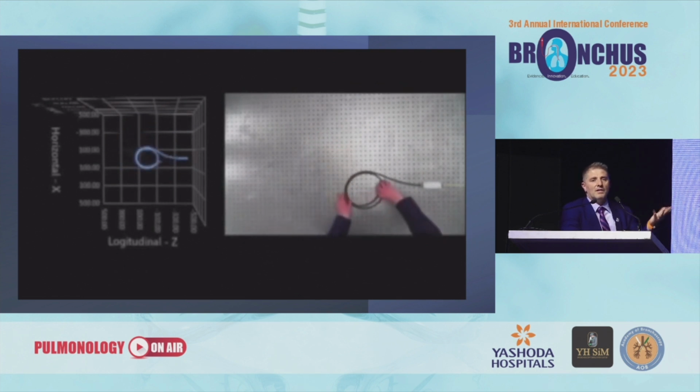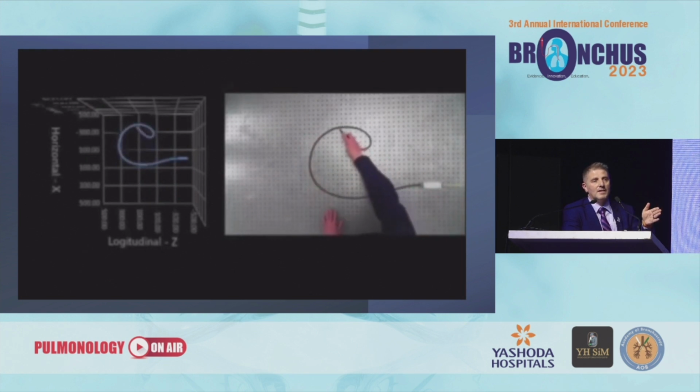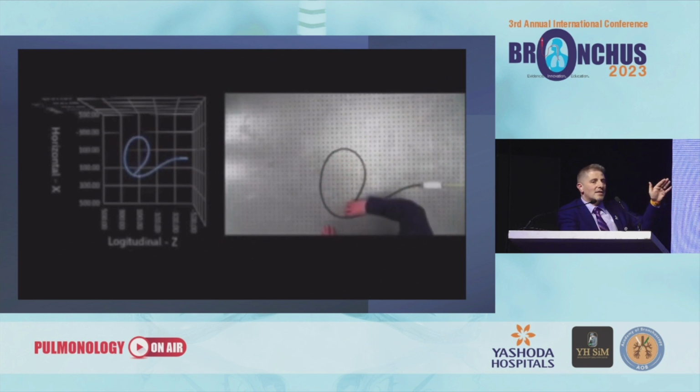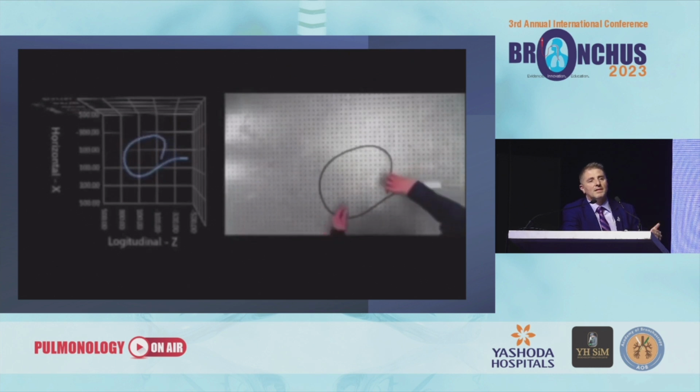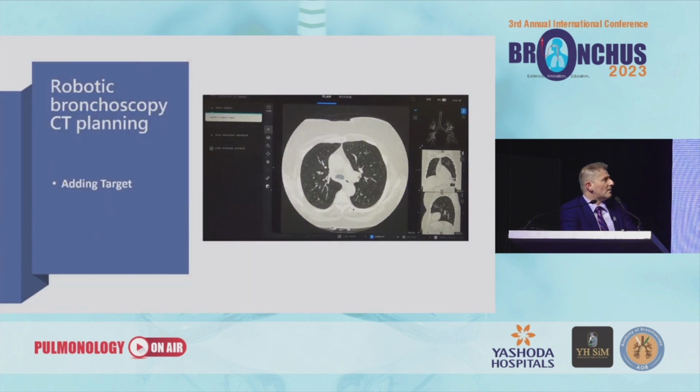And that's in 3 dimensions, which gives you the chance to really localize exactly where the catheter is with registration, and then after that with the case. Of course, that gives you the space while you're doing the procedure, and the divergence will still be there between the CAT scan that you plan the case with.